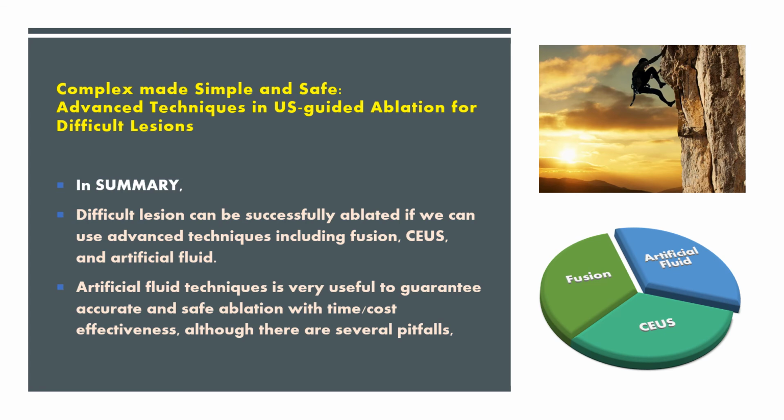In summary, difficult lesions can be successfully ablated if you can use advanced techniques including fusion, contrast-enhanced ultrasound, and artificial fluid. Artificial fluid technique is very useful to guarantee accurate and safe ablation with time and cost effectiveness, although there are several pitfalls.